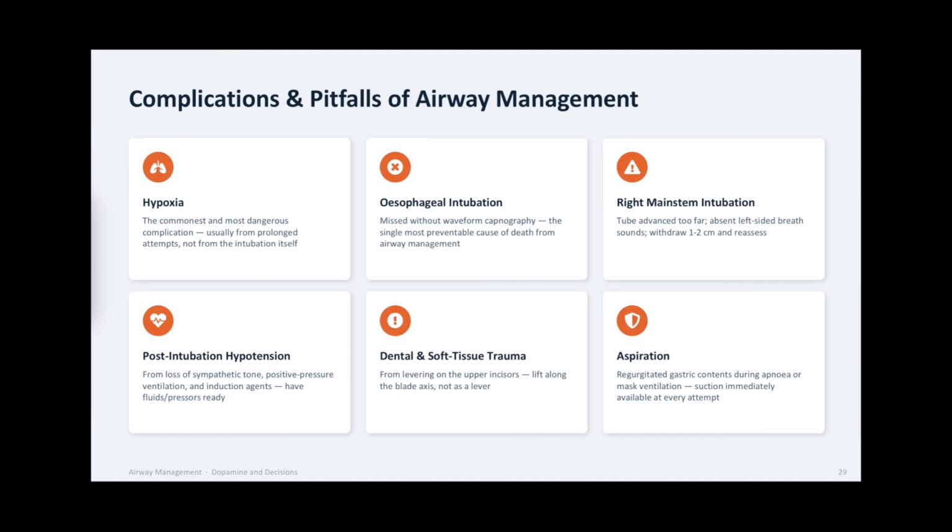Complications and pitfalls of airway management. Every successful intubation can have a complication. The most common complication is hypoxia. Usually, this isn't caused by difficult anatomy. It is caused by prolonged attempts. This is why first pass success matters.